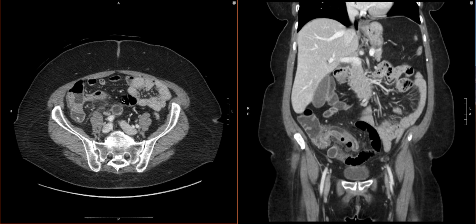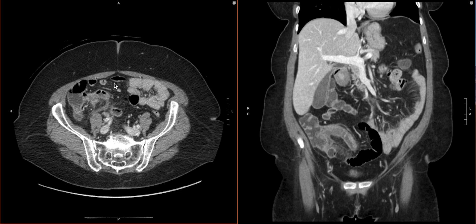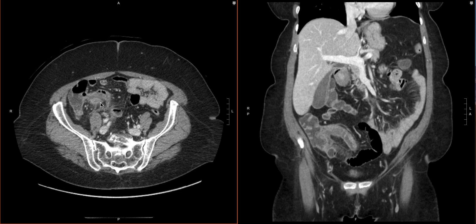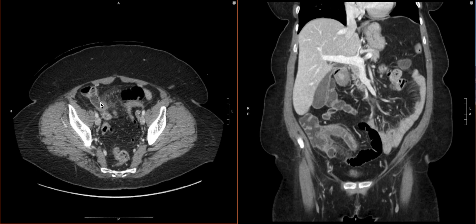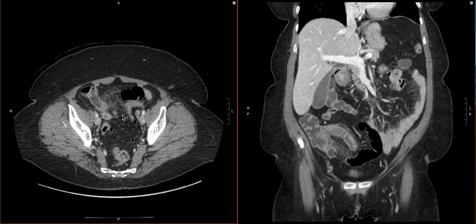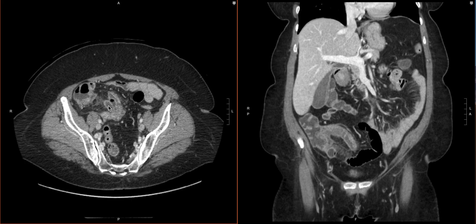We're going to find the terminal ileum first right here. We see the ileocecal valve. Right next to it, we actually see that the appendix pops off here. We'll follow it to its end. At the end of this, it's blind ending. So this is our appendix.